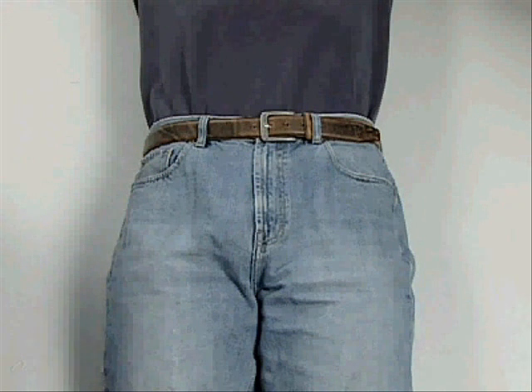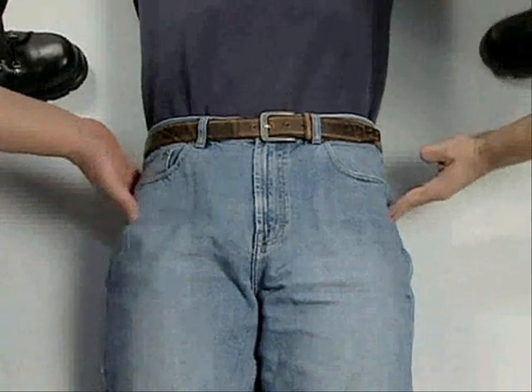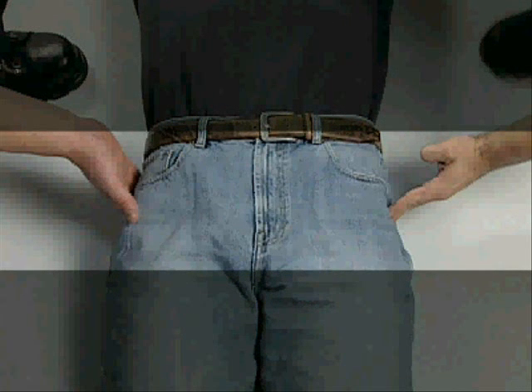Next, locate the bony prominences on the sides of the hips, called the greater trochanters. These prominences are generally at the same level of the symphysis pubis and buttocks. This is the correct level for sling application.